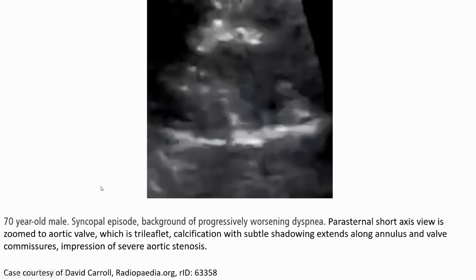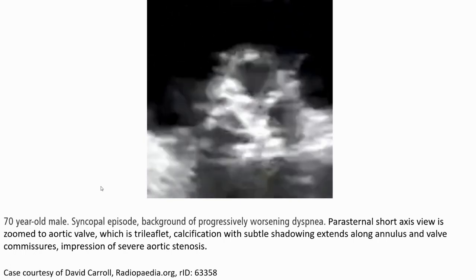In the same case on echocardiography at the parasternal short axis view, zoomed to the aortic valve, there is three-leaflet calcification with subtle shadowing extending along the annulus and valve commissures — an impression of severe aortic stenosis.